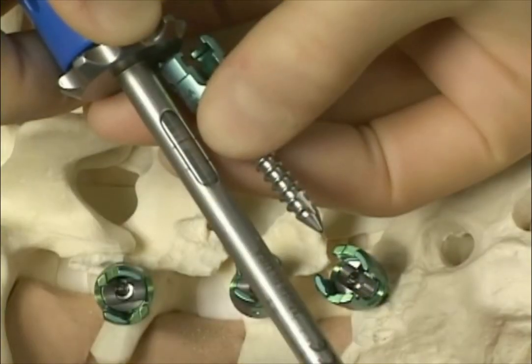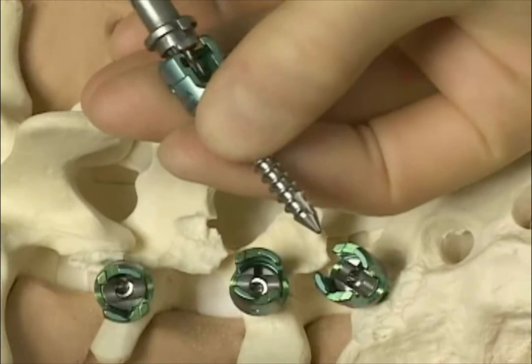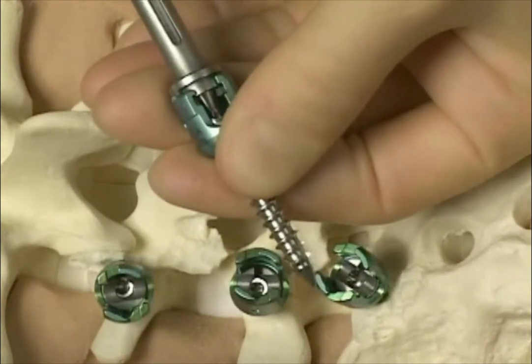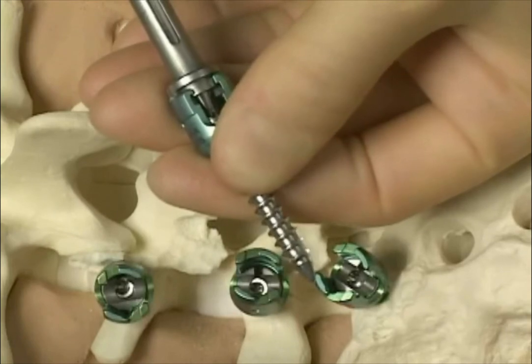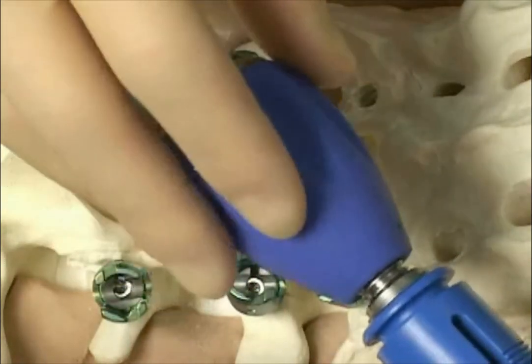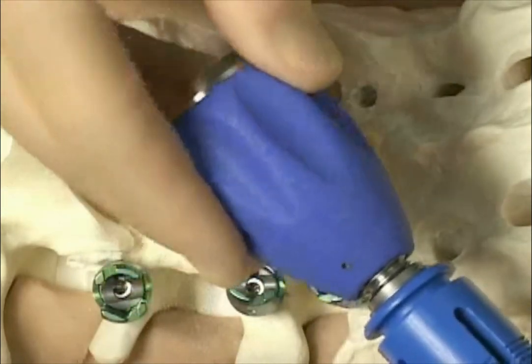The distal tip of the standard screwdriver is first loaded into the head of the screw, after which the mating surface of the driver is rotated into the screw head to initially lock the screw to the driver. Rigid locking is achieved by rotating the top blue knob of the driver.